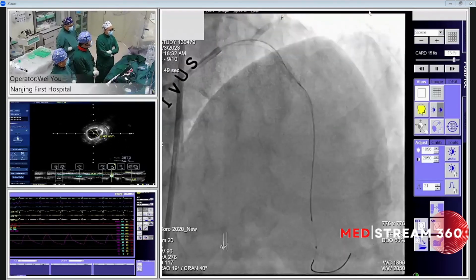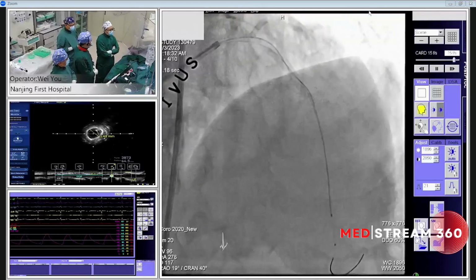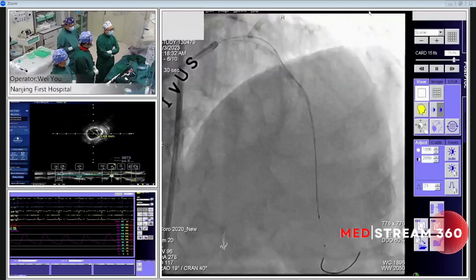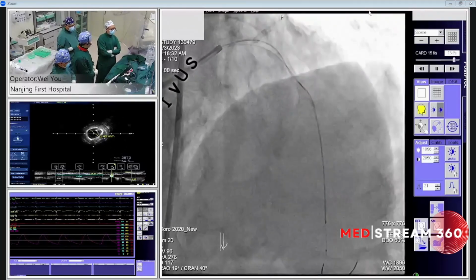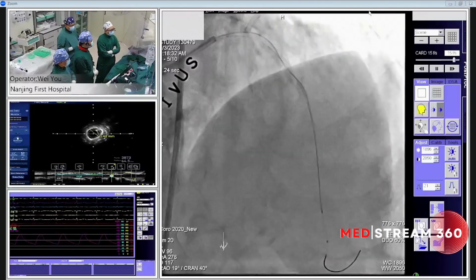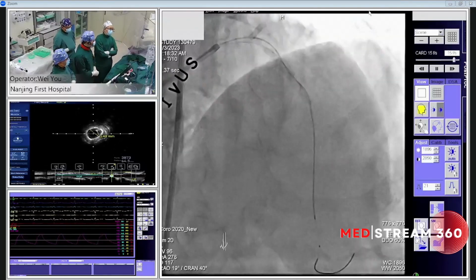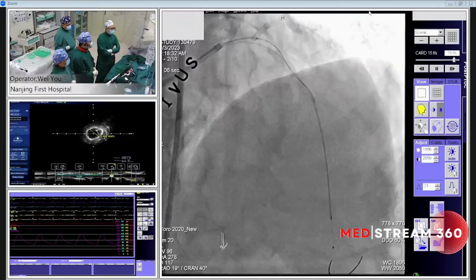So Dr. Yue, for these typical severe calcified lesions, I think before you plan to put in a stent, calcium modification is very important. For this lesion, what's your strategy? Will you use only a cutting balloon or NC balloon for predilation, or will you use rotablation, or even IVL treatment?